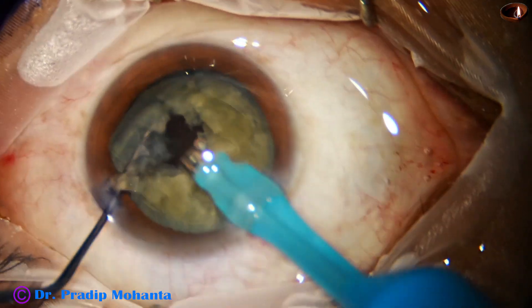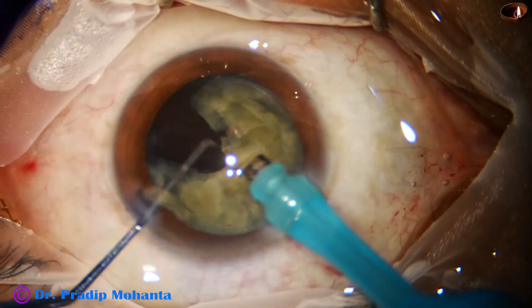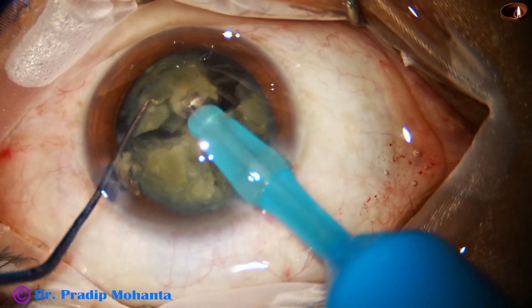Now see this — I am pulling the nucleus first and then the epinucleus here also.